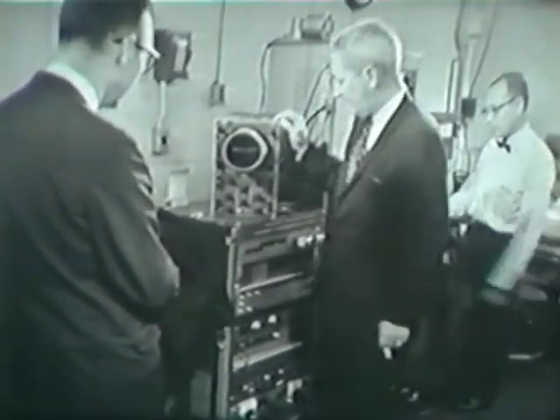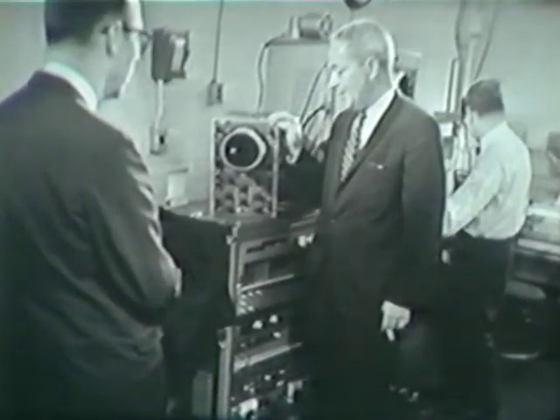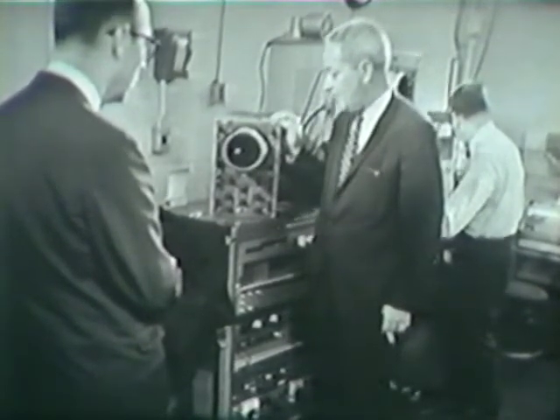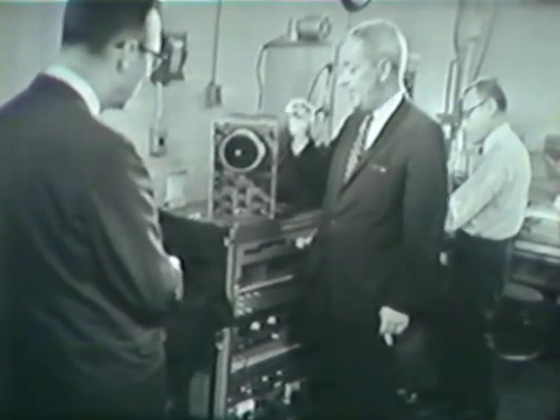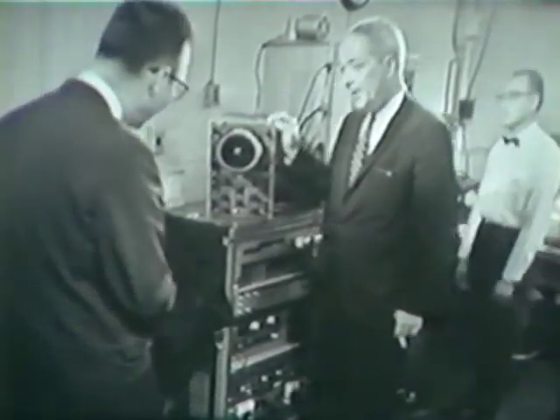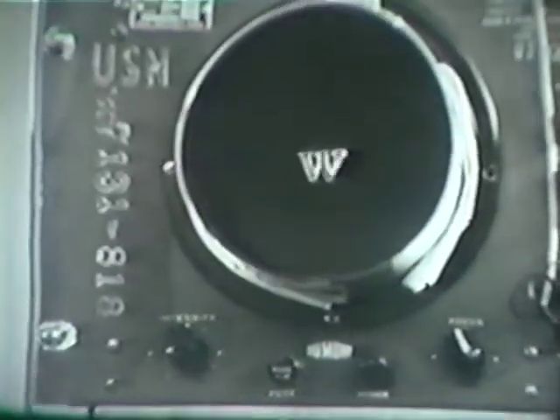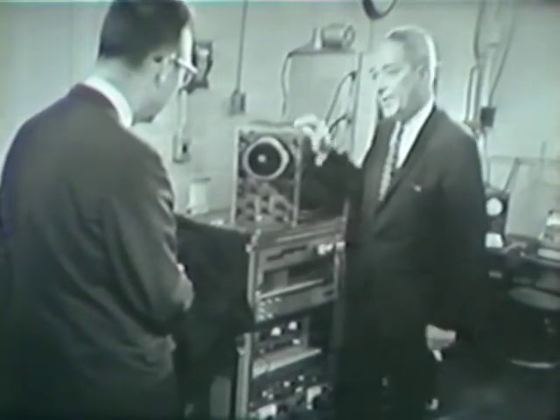And Francis can now switch into another mode of operation, in which the little spot, under the control of this special purpose computer, actually makes decisions as it goes along. It senses whether it's on black or white, and traces around the edge of the letter. Now we have just the letter W. It's sort of like a man walking around an island and maintaining his path by telling whether he's walking in water or on sand. He makes a decision and keeps on the line. So this spot can trace around the outline of the letter.